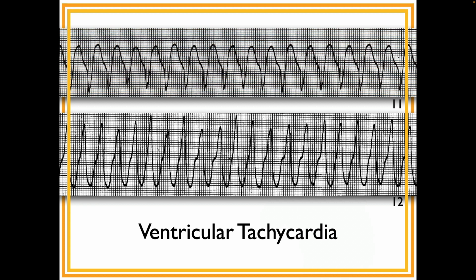Are those discernible notches in the VTAC, is that the beginning of the QRS? So in this, these are again flipped versions. VTAC is commonly just a QRS and a T wave, okay? In the top one, to the best of my ability, the QRS begins here, there's a little S and S prime, and then it looks to me like the J point is here, and then that's the T wave.